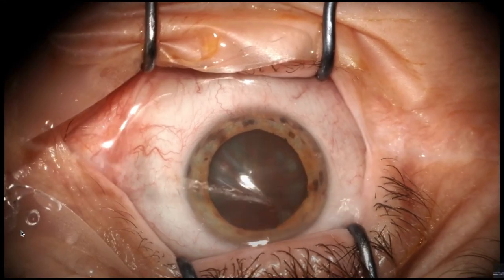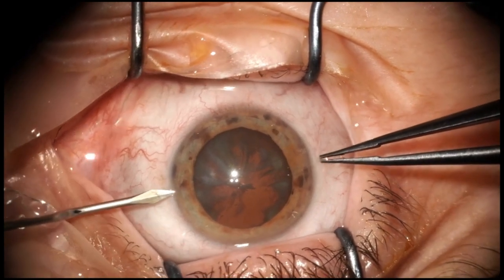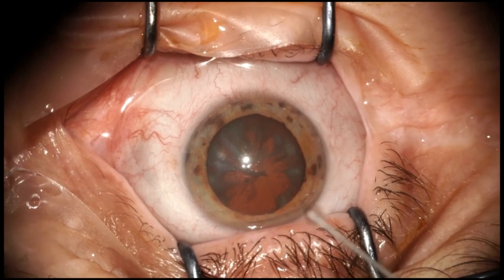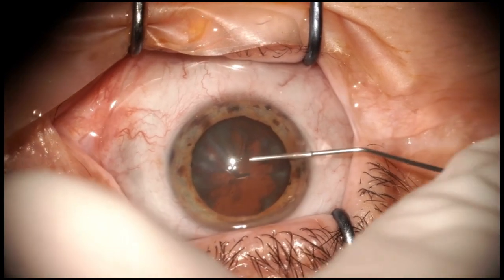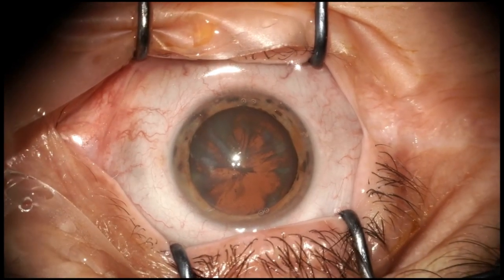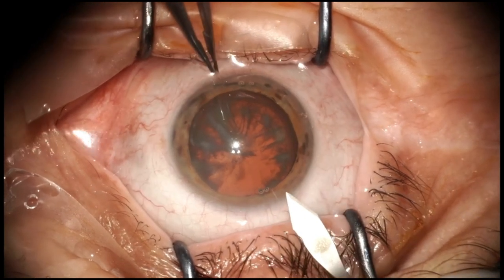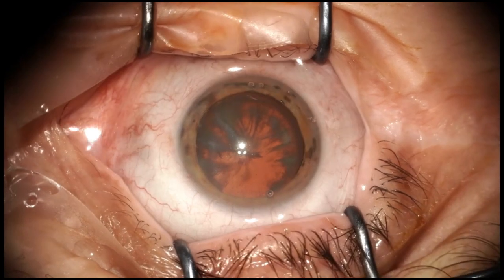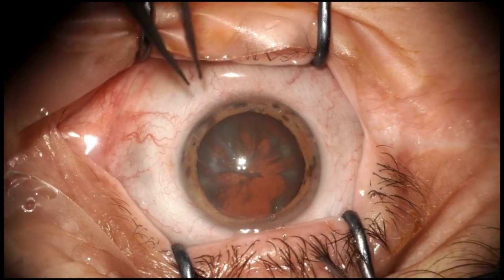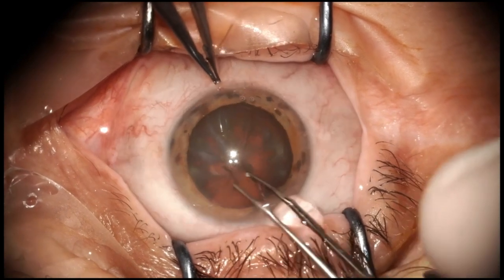This is a regular case. Is it okay? You see it? Yeah. I normally do two paracenteses, and I like to use cohesive viscoelastic, which I put in the eye before I make the corneal incision, because now the eye is firm and the incision, I think, is good and well formed. I use a 2.2 keratome, limbal incision. This is the rhexis.